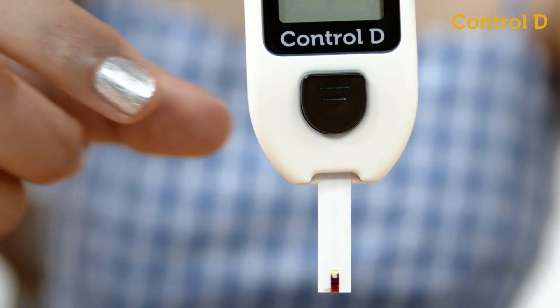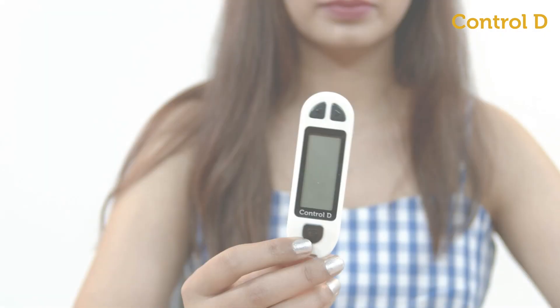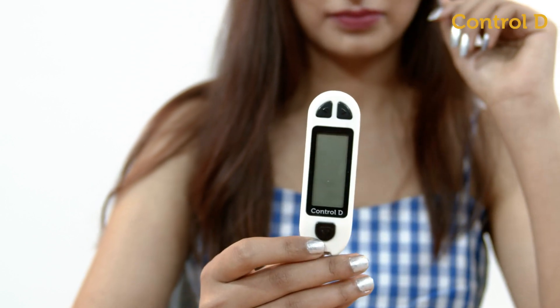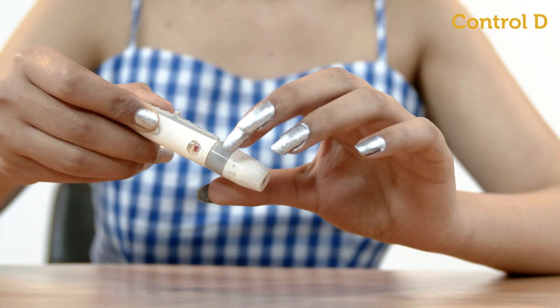Eject or remove the test strip using the ejection button, pressing downward. The glucometer will automatically switch off. Remove the lancet from the lancing device and discard.